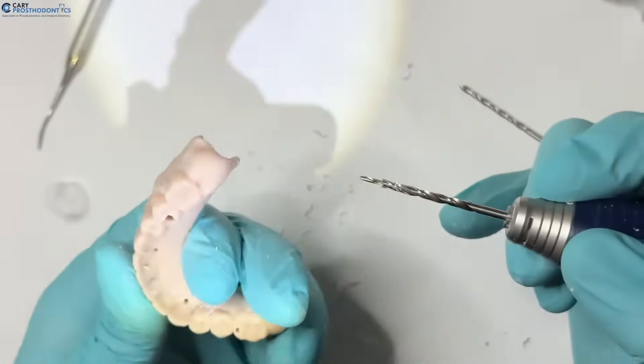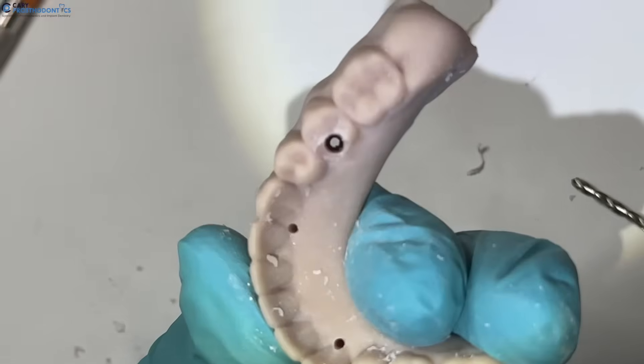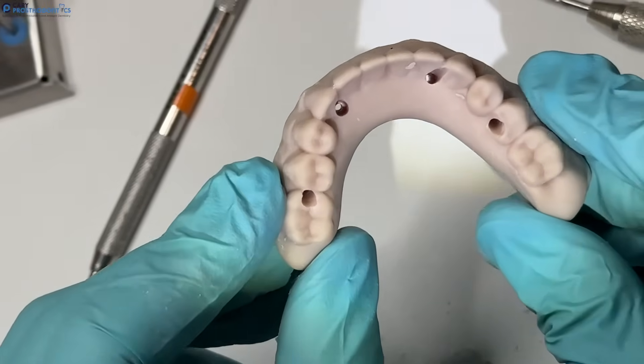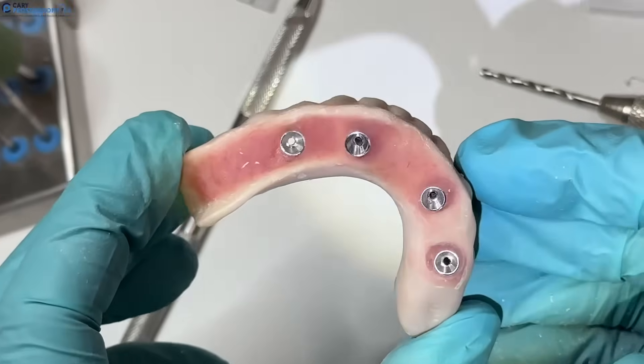Once that's done, you'll see from the inside that the separable fastener is still present and there's your screw access channel. The second drill has been done — you can see the separable fastener and a clean channel. Let me flip it to the inside.